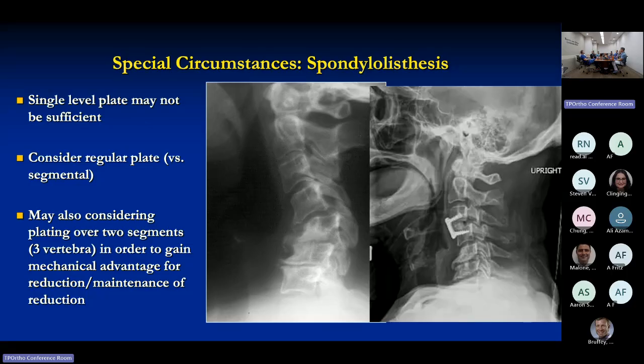But in this case, you're going to fully deploy the cephalad screws, so your plate literally rocks up relative to these bottom bodies. It'll want to do this. So you want these to be seated fully, final tightened, and then you put all 4 screws in the bottom at the same time and sequentially tighten those in and try to bring those 2 bottom vertebral bodies, and then switch. Sometimes you have to switch screws out to shorter screws because you have to start long.